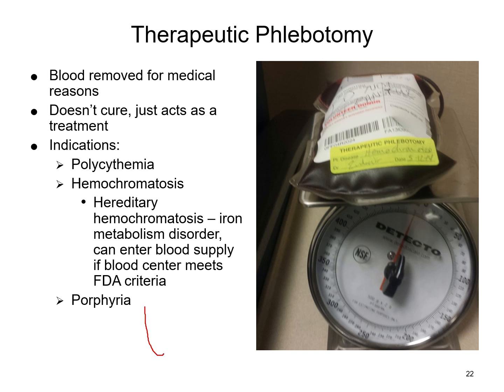When you spin the tubes down, you'll have your red cells at the bottom and your plasma at the top. You'll have a tube with the same volume, but the only difference is one has more red cells than the other, and that's an early indicator of what that patient's going to look like.